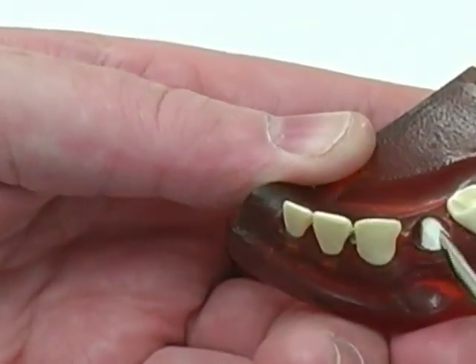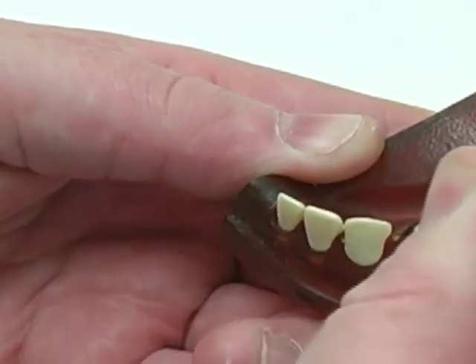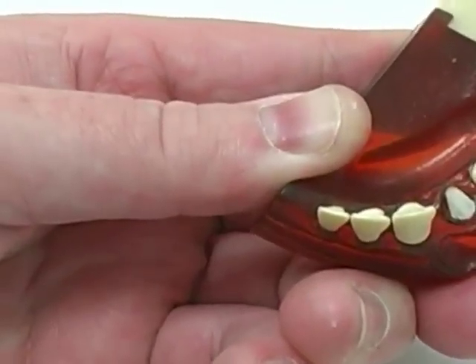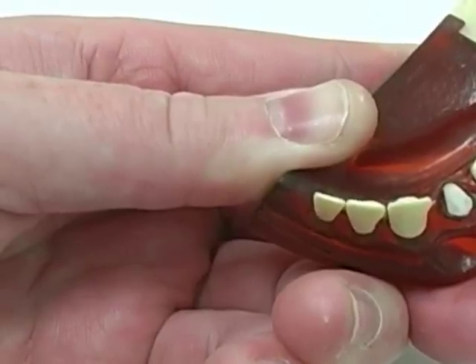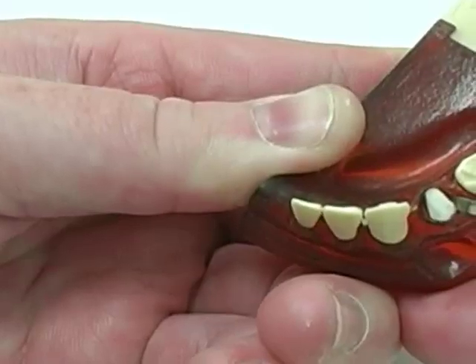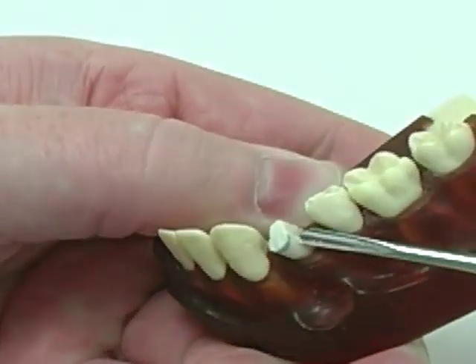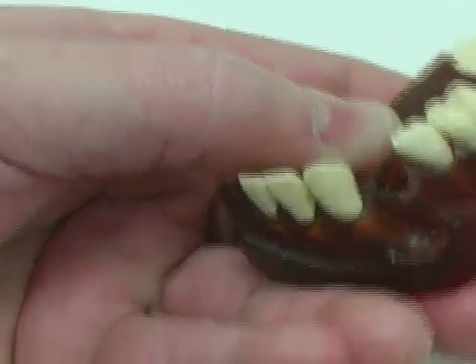The same thing can be done on the mesial. The instrument is again placed in vertical direction, squeezed in between the bone and the root, and at some point when the instrument is sufficiently into the bone, it is rotated and the root is extracted.